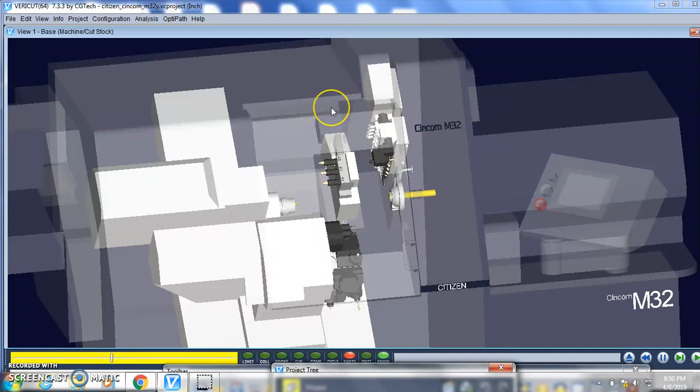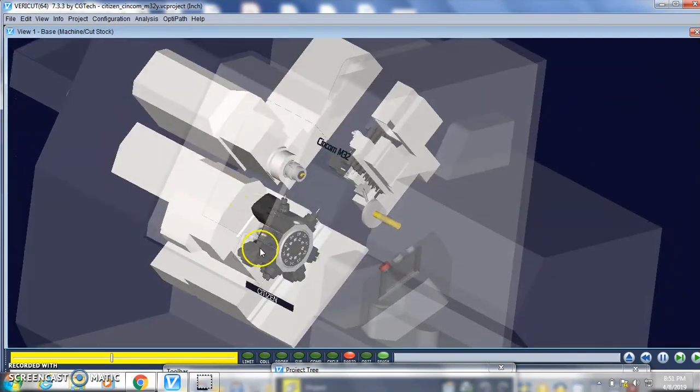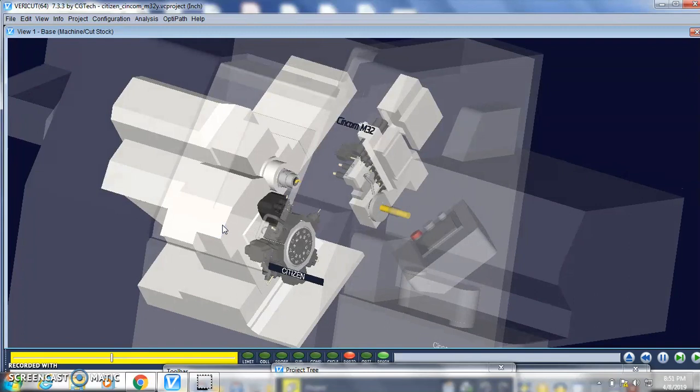If you look at the 2-hour long video, it gives you complete detail on what to expect on multi-channel machine capabilities, because these come with a phenomenal ability to reduce the cycle time. If you select the best tooling and best possible process, that will be the optimum cycle time you will achieve in programming these parts. Okay, let's look at one of the common machine tools out there for screw type machining. This one has 3 different channels, or 3 different mechanisms, that control how the part program is processed.